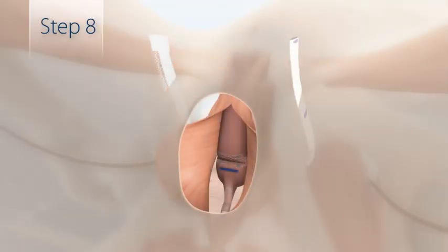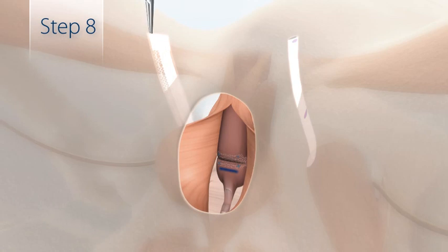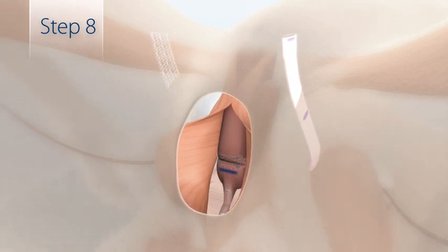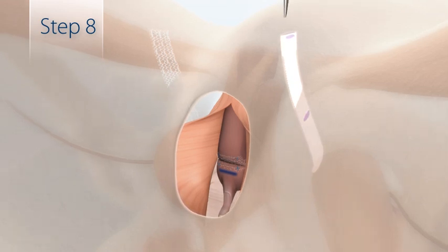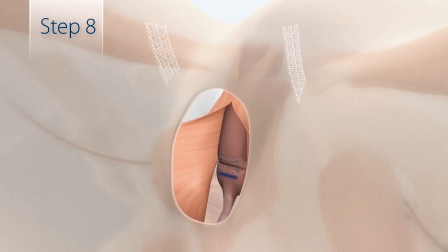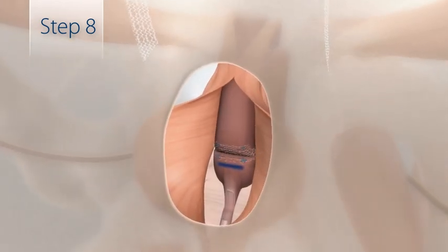Once correct positioning is achieved, remove the sheaths from the sling as demonstrated here. Pull the sheaths perpendicular to the patient's abdomen, avoiding creating acute angles of the sling arm during removal. Note the sheaths are comprised of 2 layers, a plastic outer portion and an inner protective Tyvek liner. Both are bonded together to allow for simultaneous removal.